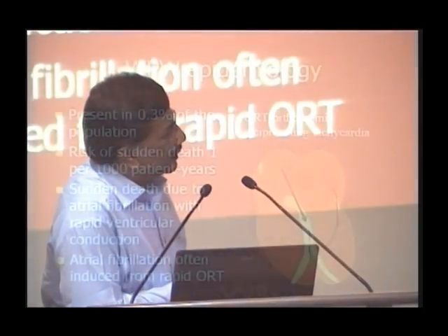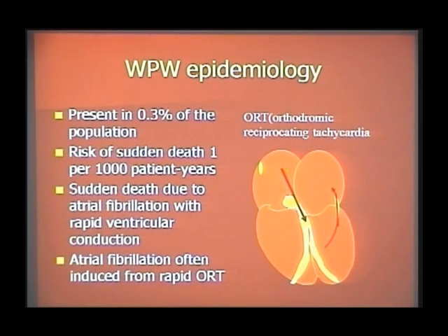I can say it here. This is orthodromic tachycardia, where in my re-entry circuit the anterograde conduction is coming through the normal pathway to produce depolarization of the ventricle through the intact bundle, and it is getting back through the accessory pathway and forming the re-entry circuit which precipitates the tachycardia. So in orthodromic tachycardia, the QRS complex is narrow. So you can have an SVT with a narrow QRS complex tachycardia, which is most often the case, and most often it can be cured with medicines and so on. It is not very dangerous.